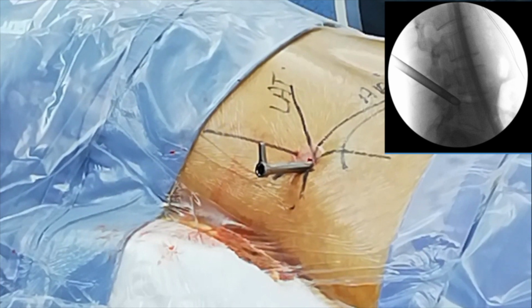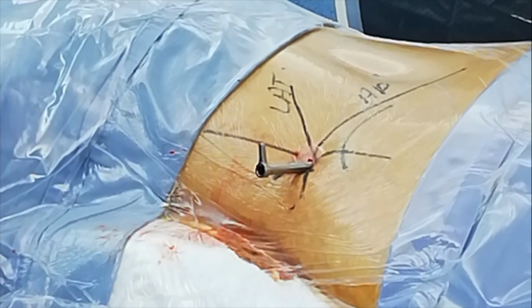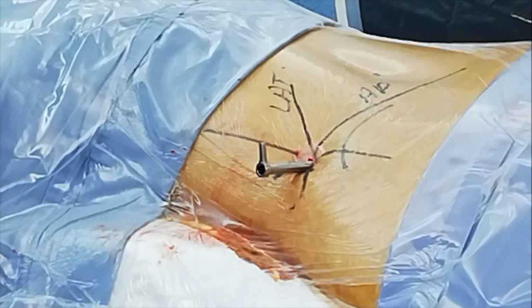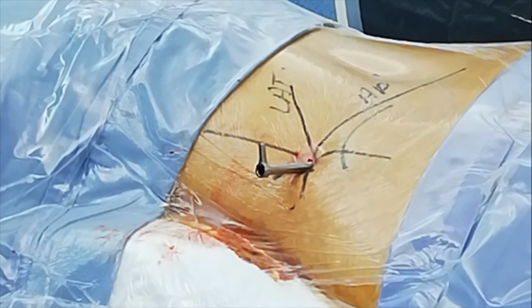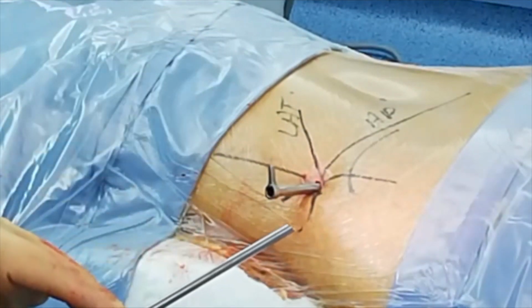Okay, wonderful. So away from the exiting nerve root, not in the disc space, on the lateral, and we are definitely in the recess. And that's the easiest way for us to put this scope and look at the anatomical landmarks, the facet and the pedicle and the posterior vertebral wall. So we're done with X-ray, so thank you. So now I'm going to introduce the endoscope, and then we will follow everything on the monitor.